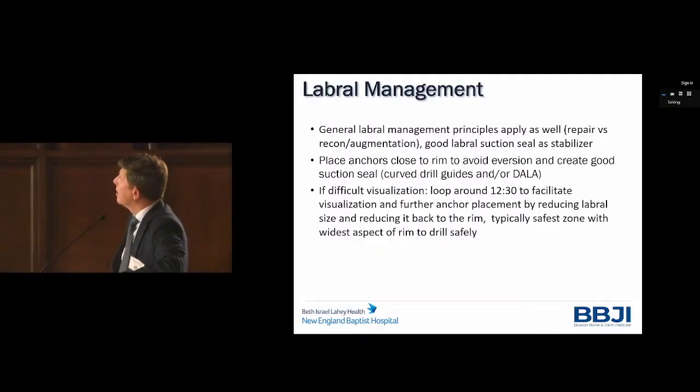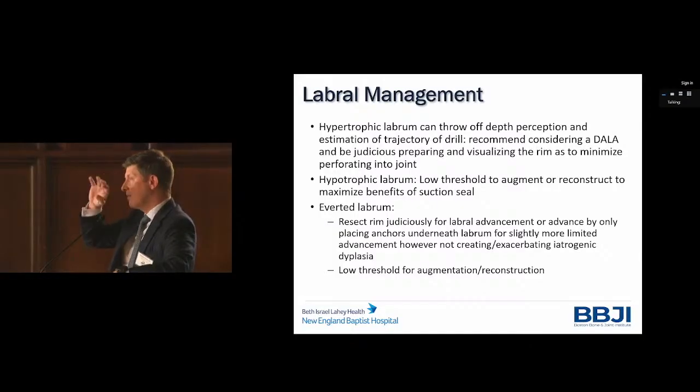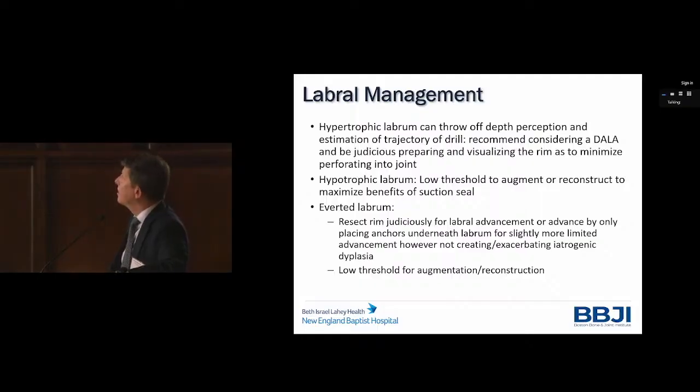A hypertrophic labrum can also throw off depth perception, I feel. With a normal-sized labrum, the depth perception of where the drill guide will go is different than with a large labrum, so it can throw you off a little bit. Again, the DALA can be helpful here.